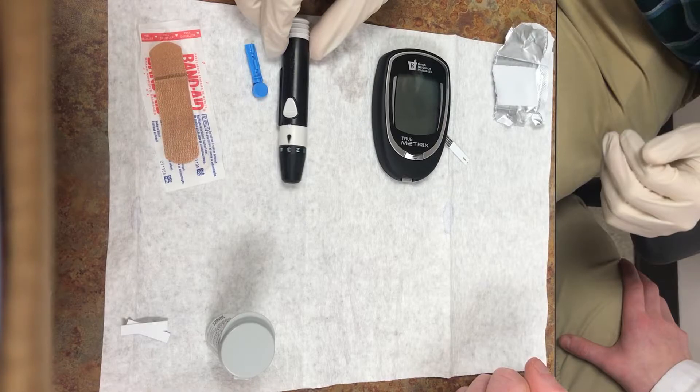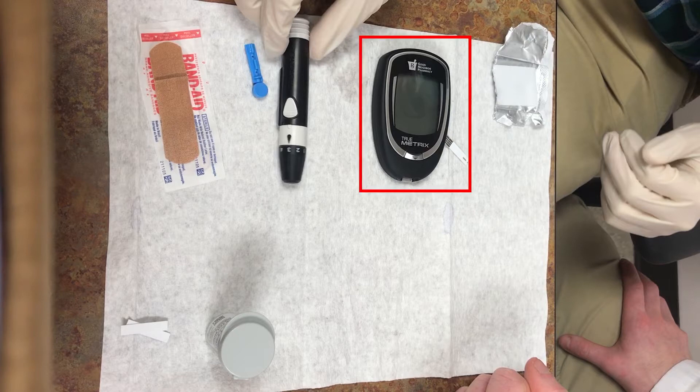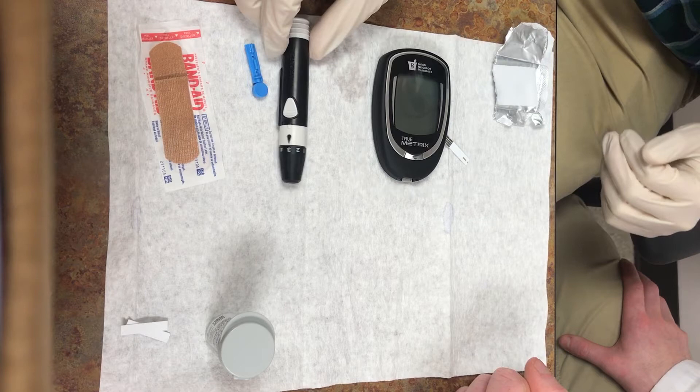Hello, we are Operation Diabetes at Campbell University. Today we are going to review how to monitor your blood glucose levels. First, we will show you how to use a glucose meter. Then we will discuss what the glucose readings mean and how to interpret them.